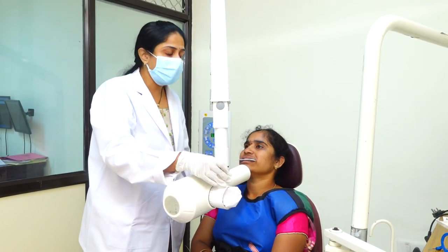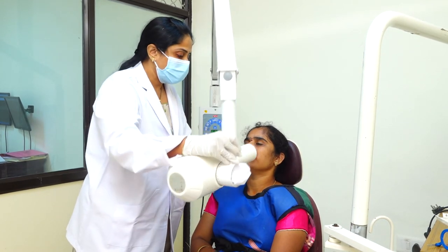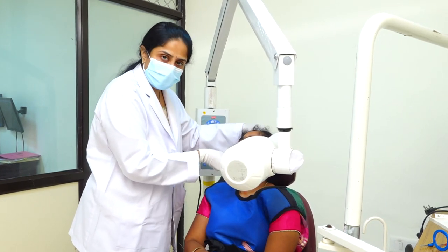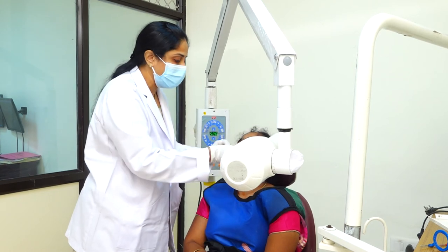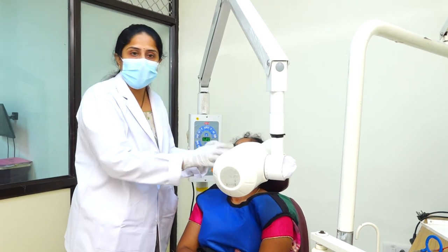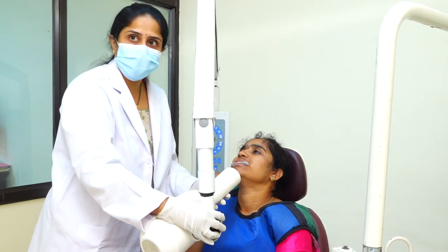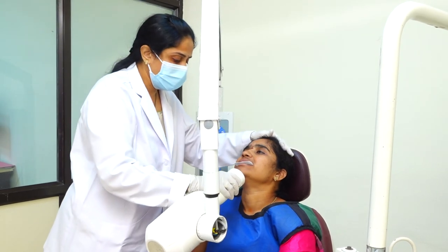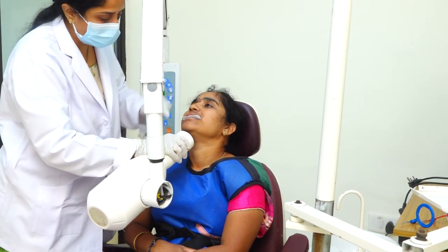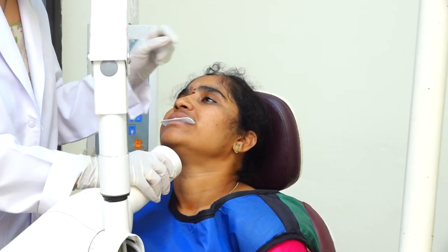Let's have a demo on the mandibular topographic or mandibular cross-sectional radiograph. Here, the patient's position should be semi-reclined. The film should be pushed a bit backwards so that it touches the ramus of the mandible. The exposure point should be 3 centimeters below the tip of the chin.